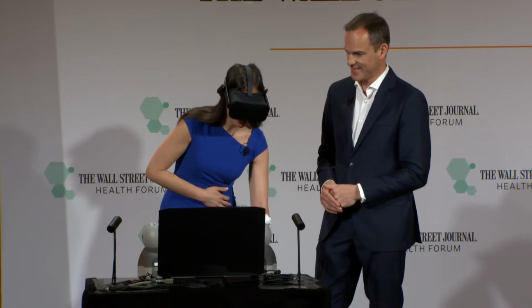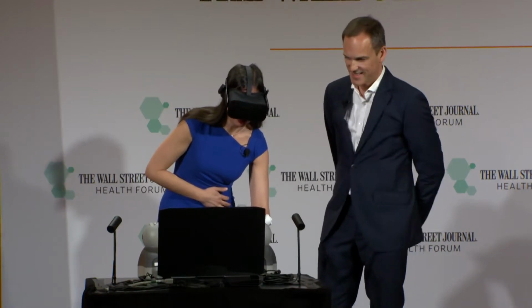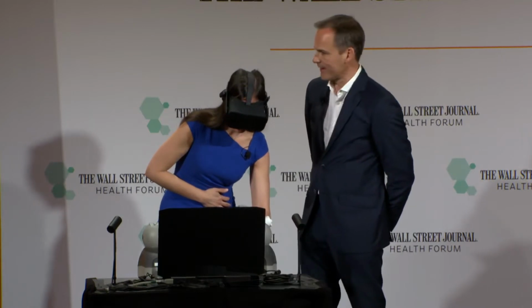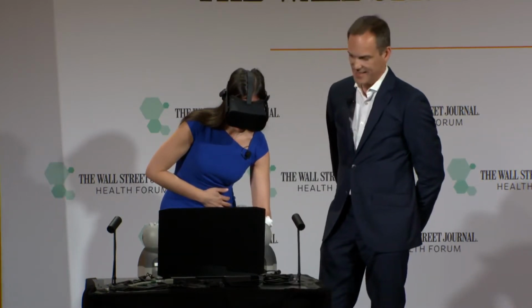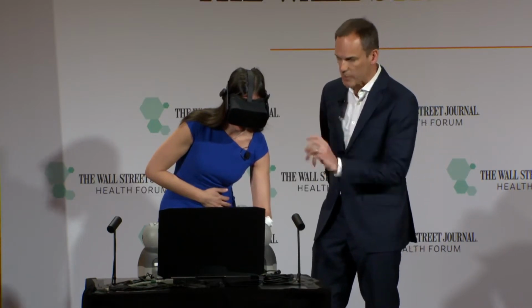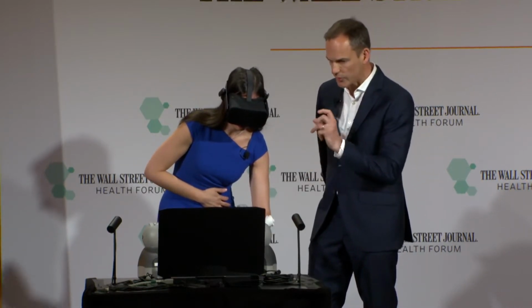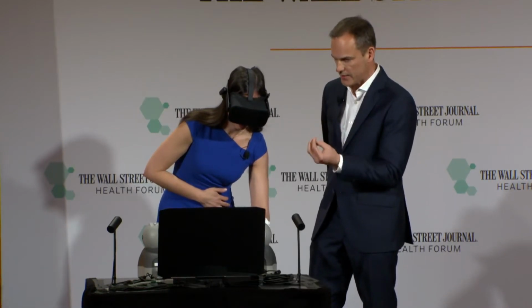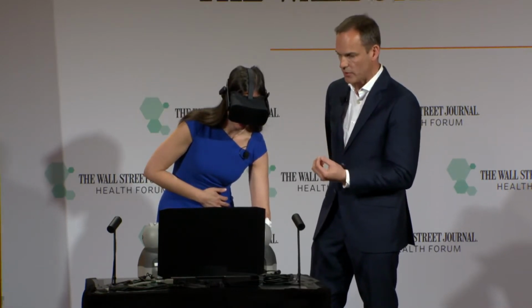So you really feel like you're drilling. I'm not a builder either, but I feel like it would feel something like that. So you just look down a little bit. There you go. Perfect. So the texture's starting to change a little bit. Why is that? So as you're starting to ream through, it's smoothing off the surface, and that's what you're feeling for, that smoothing effect. And once the texture goes quite soft, then you're really complete.